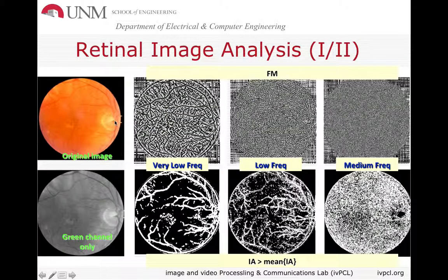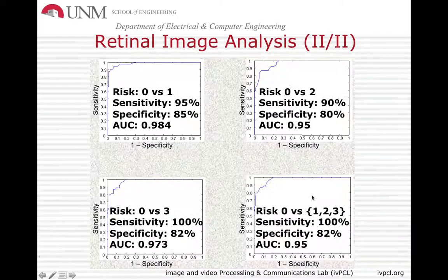Here's an example for Dr. Murray. This is a retinal image. This is the original picture that, although it's been analyzed by humans in its current form, using these AM-FM techniques, the computer turns that into binary formation of different extractions. For example, as you can see over here, these white pixels were colored to show where blood vessels are, and analyzing their structure. Notice how the computer decomposition produces many different images, extracting different versions, and then they're used to classify. So this is the final output, showing you a great promise of the system.